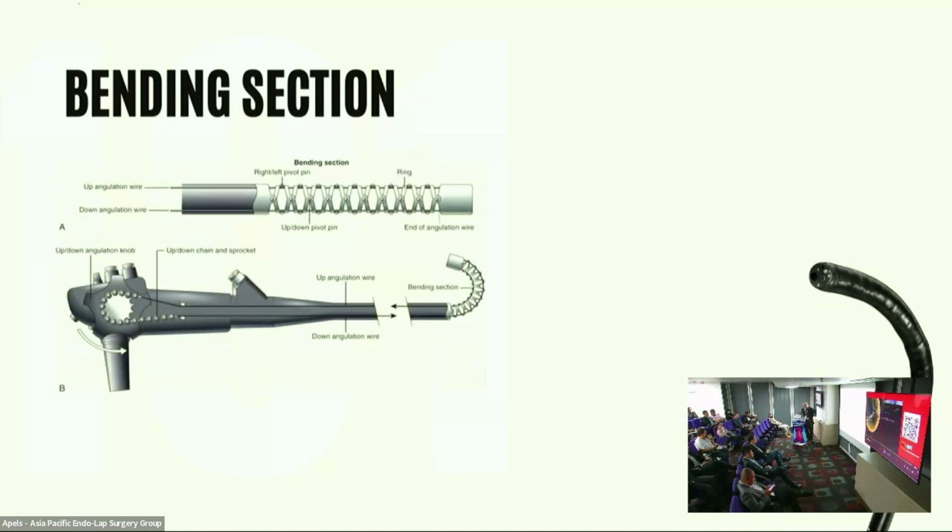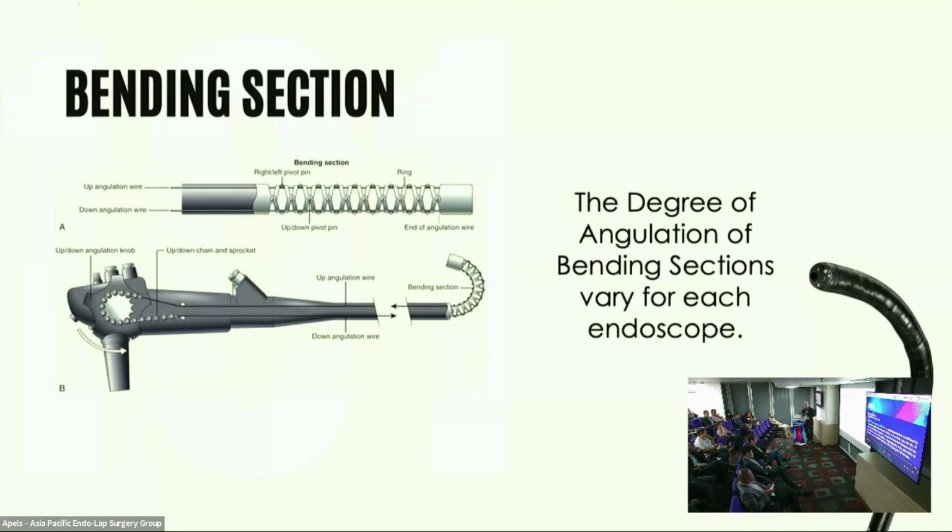So the bending section, there's like a long pulley inside, wherein if you turn the knob, it will bring the bending section up, and the opposite side will bring the bending section down. So that's how it works. So we have to protect that with this resin so that it doesn't get contaminated with water, since water causes erosion and damage to our electronics.